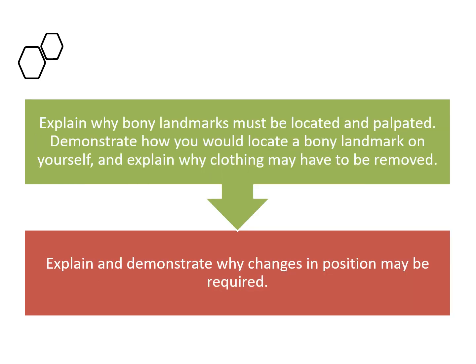Then you have to take consent from the patient for exposing that particular part, because you need to locate the landmark, you need to palpate for the landmark. So before that you need to explain why you need to palpate for the landmark, what you are looking for. Not all patients will be comfortable in exposing or removing clothes.